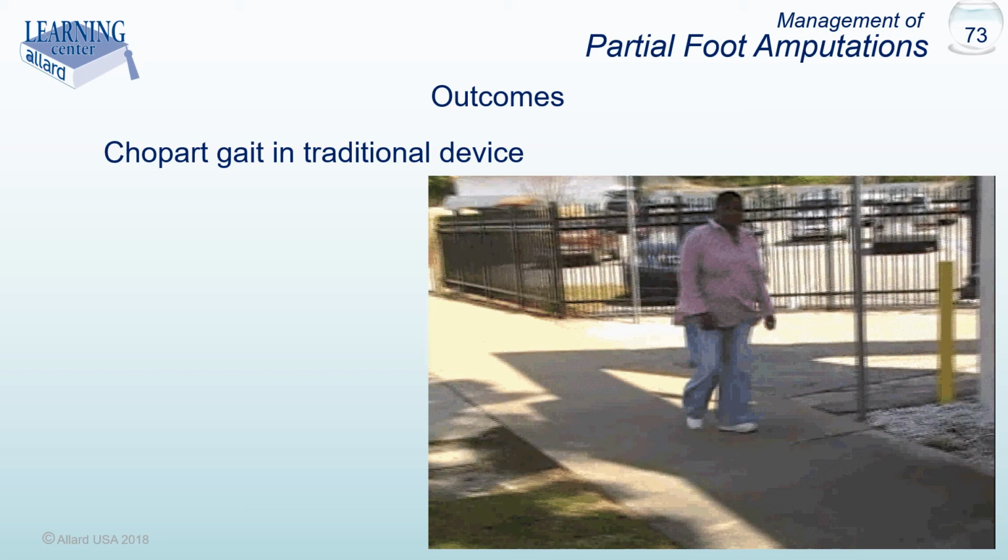Notice not only the asymmetries in her gait and the work that she puts into it, but notice also how rigid her trunk is as she walks. Walking for her is not fun or safe or productive.